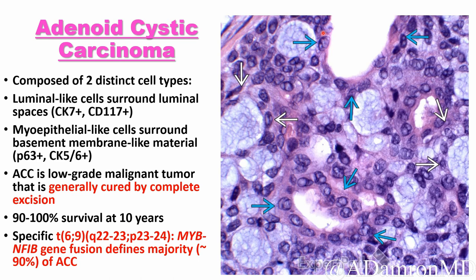In classic adenoid cystic carcinoma, the two distinct cell types are: luminal cells in the luminal spaces, positive for luminal markers like CK7 and CD117; and myoepithelial-like cells surrounding the basement membrane-like material, positive for myoepithelial markers like p63, CK5/6, calponin, and others. This is a low-grade tumor when classic features are present - actually generally cured by complete excision with excellent survival. These patients generally don't need radiation or chemotherapy, though if you send them to Oncotype or similar tests they'll come back with a high score because they're triple negative - but clinically we know they behave very well.